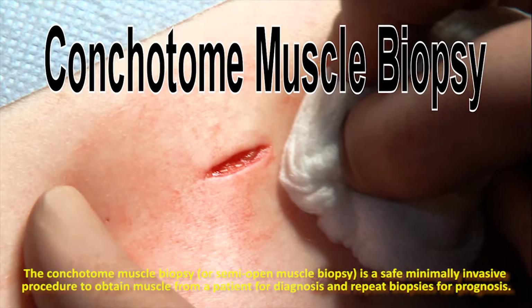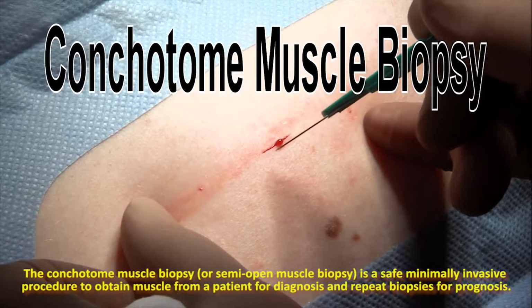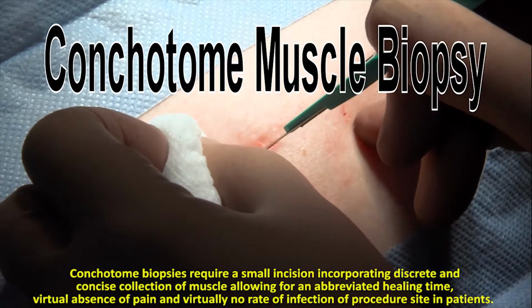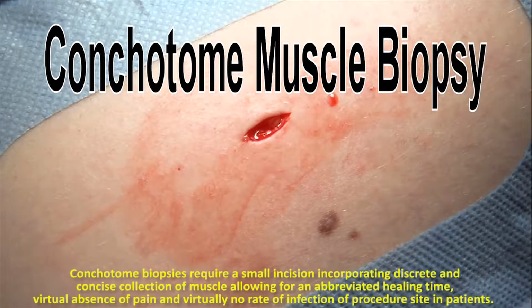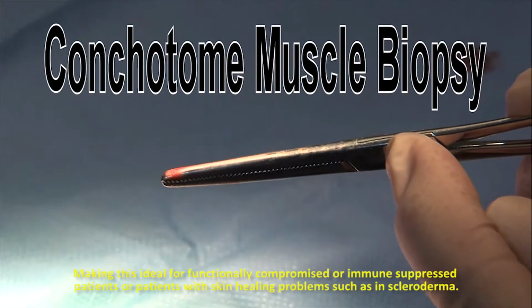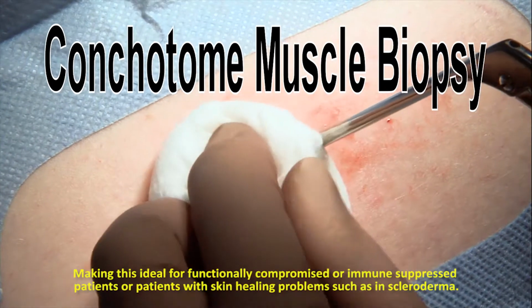The Conchotome muscle biopsy, or semi-open muscle biopsy, is a safe, minimally invasive procedure to obtain muscle from a patient for diagnosis and repeat biopsies for prognosis. Conchotome biopsies require a small incision incorporating discrete and concise collection of muscle, allowing for an abbreviated healing time, virtual absence of pain, and virtually no rate of infection of the procedure site, making this ideal for functionally compromised or immune-suppressed patients, or patients with skin healing problems such as scleroderma.